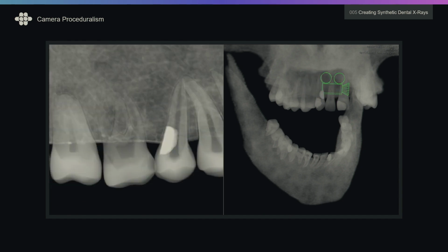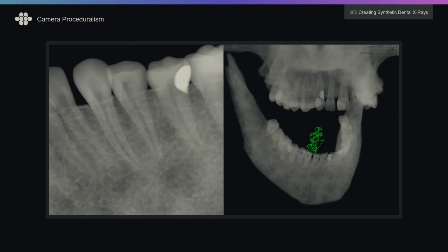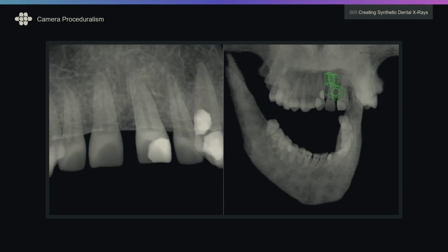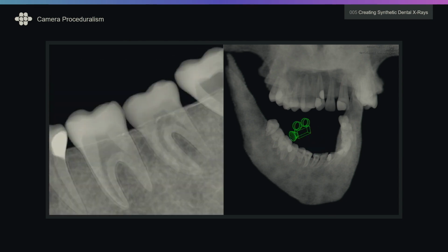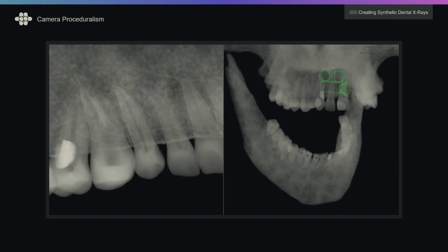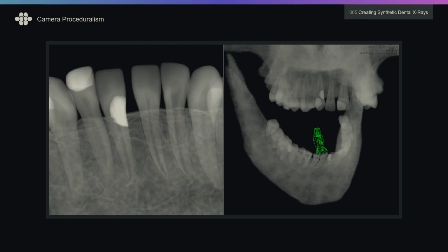One of the things that came about from revisions on this is there's no optics, so using an orthographic camera resolves that. And then understanding that the sensor is on the inside of the mouth and not the outside makes very subtle differences and really messes with the tooth identification or tooth classification, because then the roots are backwards.